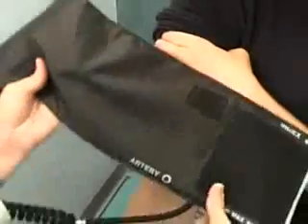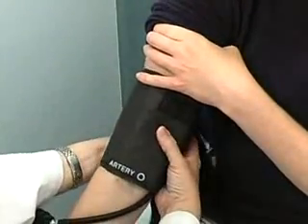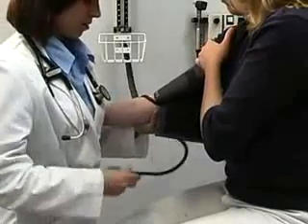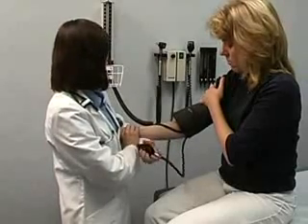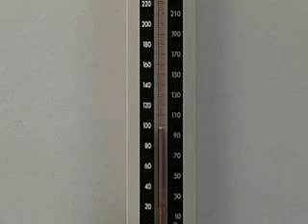Place the cuff just above the elbow. Most cuffs have a marking that should be placed over the brachial artery, located towards the medial surface of the cubital fossa. Palpate the brachial artery prior to assessing blood pressure. Support the patient's arm at heart level. While palpating the radial artery, inflate the cuff until the pulse disappears. Deflate the cuff slowly to confirm the pressure at which the pulse disappears. This point is your estimated systolic pressure.